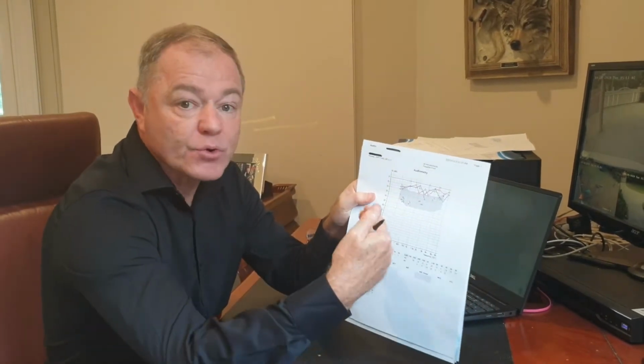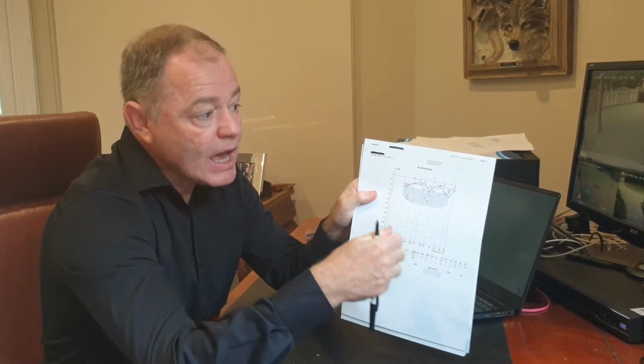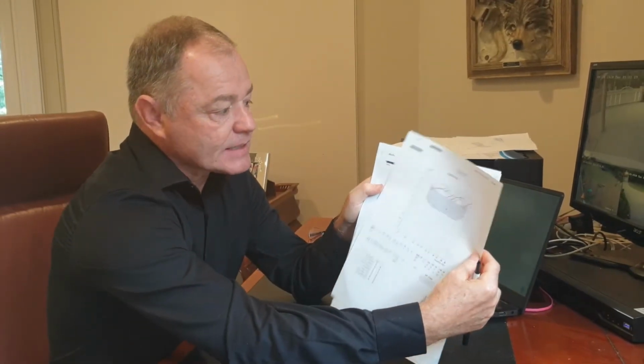So let me just run through a couple of graphs with you so that you can see various types of hearing losses. And then I'm also going to show you another test that we do, which basically is designed to give us an idea of where the loss actually is occurring in the ear physically.